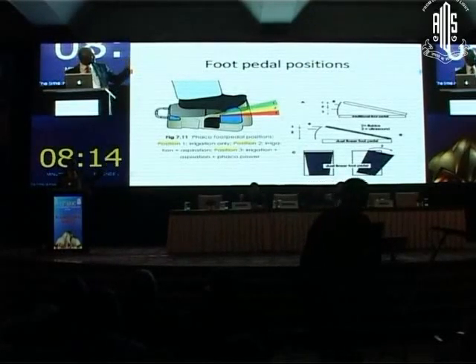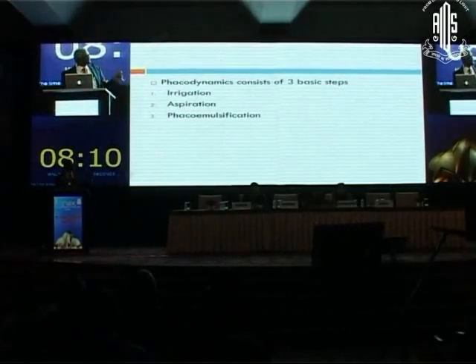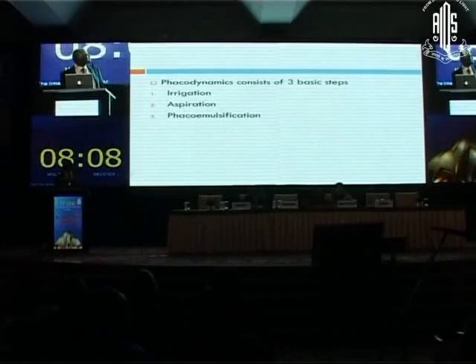The foot pedal has 3 positions. The phaco-dynamics consists of 3 basic steps: irrigation, aspiration, and phaco emulsification.